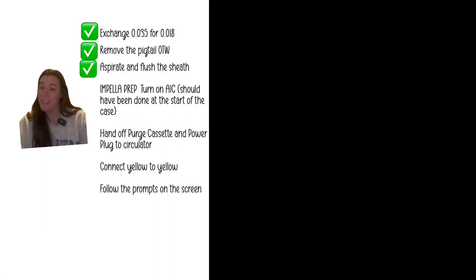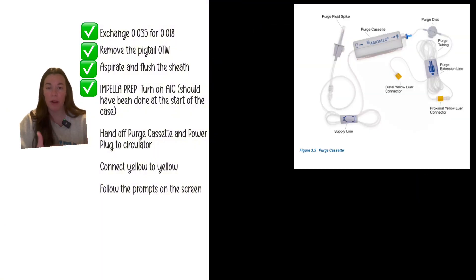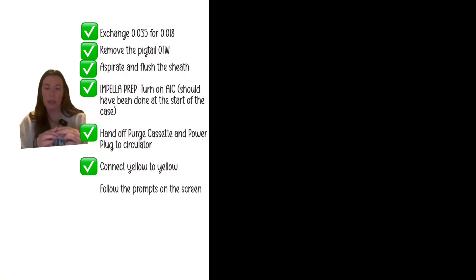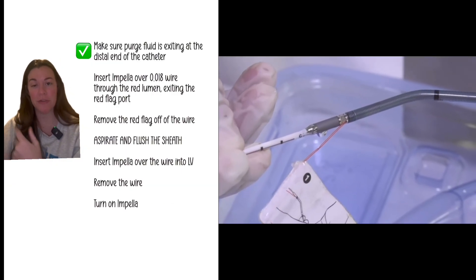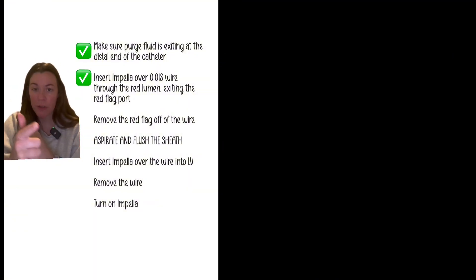On the Impella prep side, you should have already turned on the AIC console, which will walk you through the catheter prep steps. Hand off the purge cassette and power plug — which come in the Impella catheter kit — to the circulator so they can set up the purge fluid. Connect yellow to yellow: the yellow port on the Impella catheter to the yellow port from the purge fluid. Follow the prompts on the screen; it will flush and purge through, and you should see purge fluid dripping at the end of the catheter.